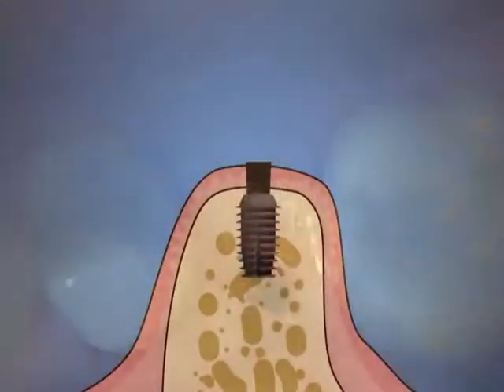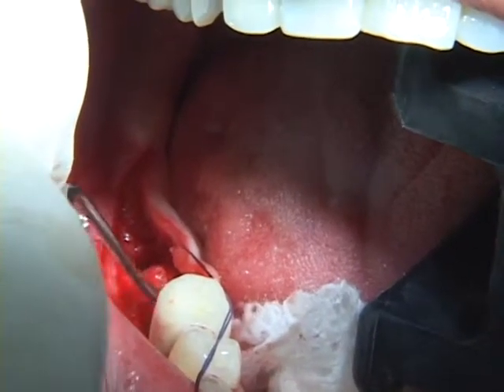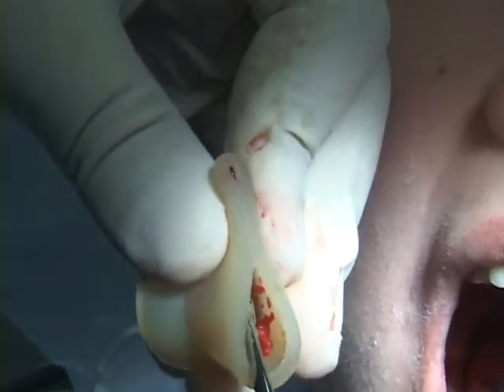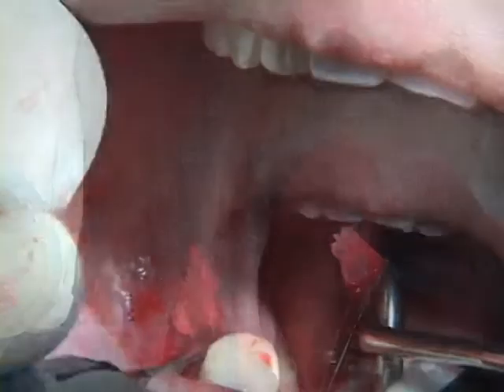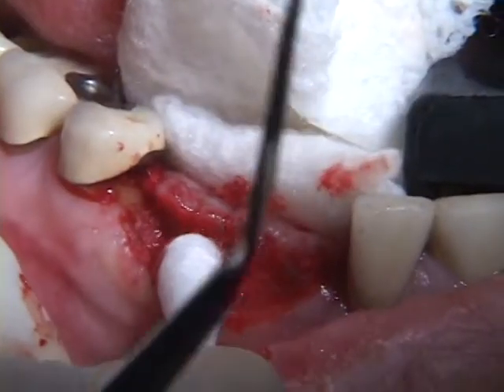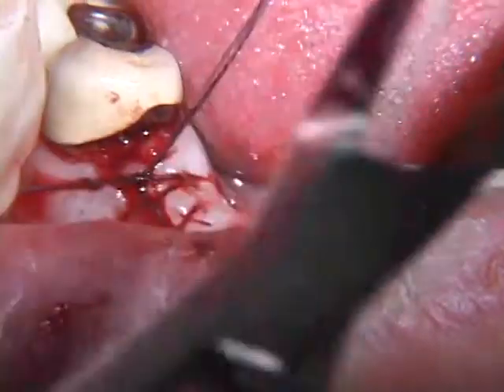Alternatively, healthy soft tissue can be achieved by inserting a healing plug that is definitively transmucosal, as though it were a one-stage technique. After the healing plug has been inserted into the well of the implant, the bone that was collected in a flexible silicone Dappen dish during the preparation of the osteotomy is gently packed around and over the implant. In order to prevent seepage of oral fluids into the implant site, it is desirable to achieve a tight closure with the suturing of the mucoperiosteal flaps.